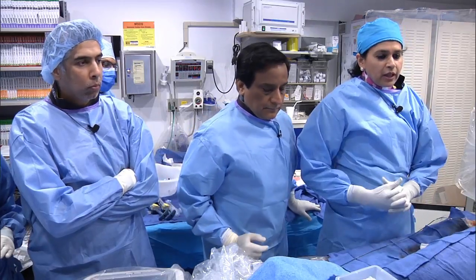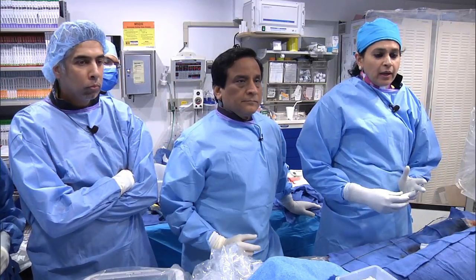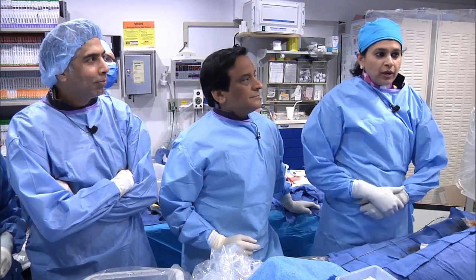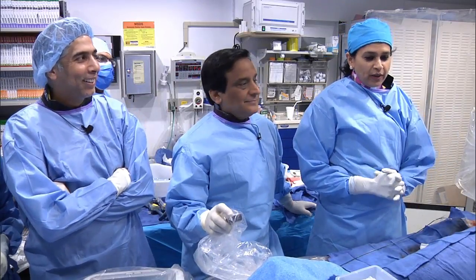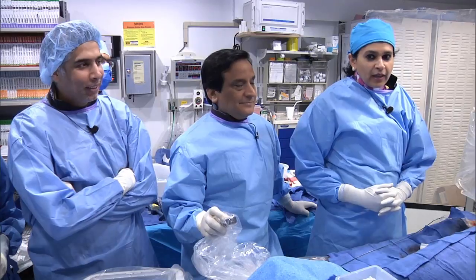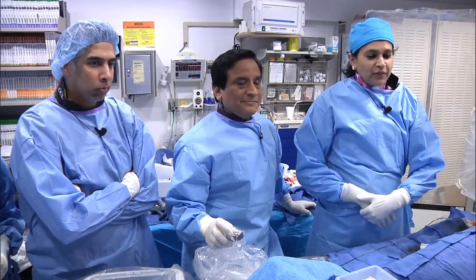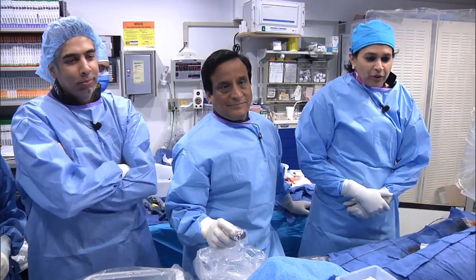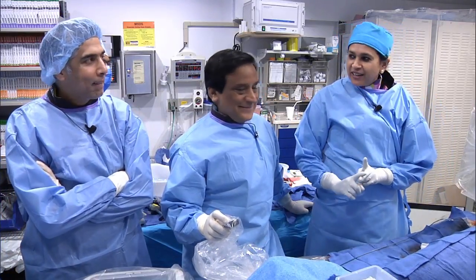And I think like Nitin mentioned, definitely left radial is probably a better access, the catheters available are better, the placement of the catheter, everything is better. But I always say if you're going for left radial access, you need to get a spa that day and night, every time. No matter what, it's very difficult to find a patient who has a flat belly. So you get the radial access, you bring the left arm this side, you can never get the left arm, and you are all over the patient, probably more radiation and you develop back pain, which right now we don't have despite having done so many procedures. So that's the main reason, two reasons: radiation exposure, and left radial is back pain.